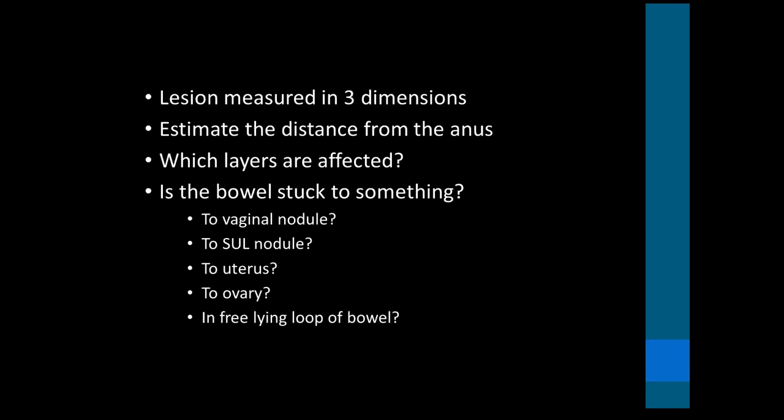We will also try and assess which layers are affected. That's probably something that you start doing when you get more experience in looking for deep infiltrating endometriosis, and then describing whether the bowel is stuck to something. Is it stuck to a vaginal nodule, to a sacrouterine ligament nodule? Is it stuck to the uterus, to an ovary, or is the lesion in a free-lying loop of bowel?